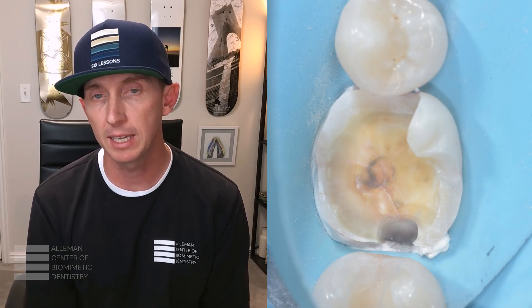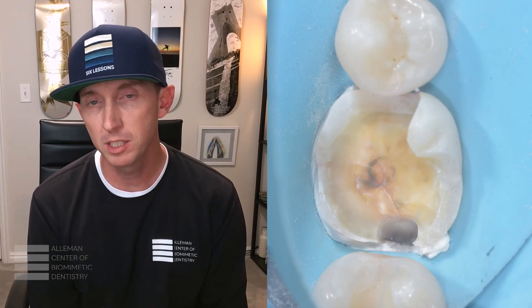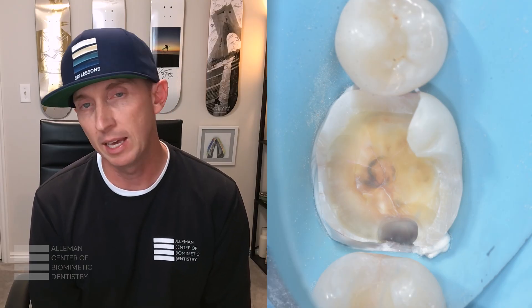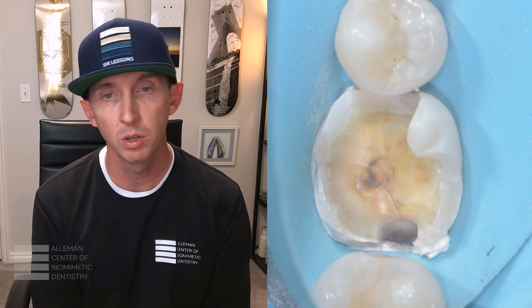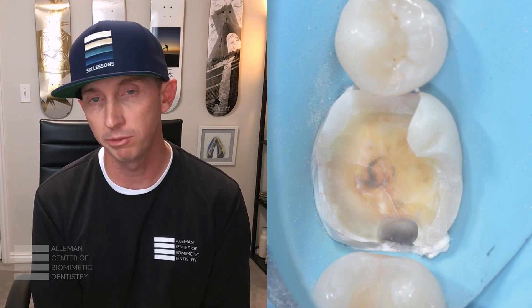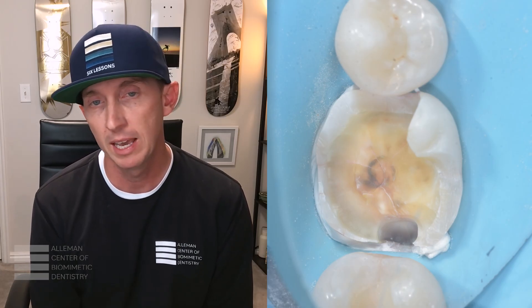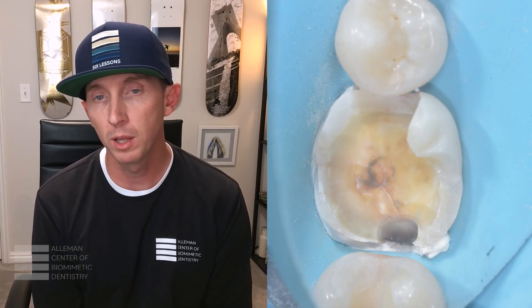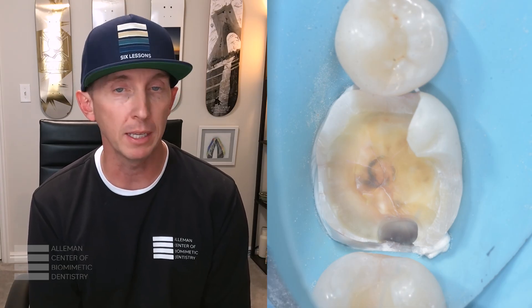This has made many dentists hesitant to embrace the idea of a deep margin elevation. This is not a new concept — it was introduced in the literature back in 1998. As we've continued to follow these cases over the last two and a half decades, we are beginning to feel more confident that the biologic width dogma is a myth, and that if you do your adhesive protocols properly, you will have healing — eliminating the need for crown lengthening surgery in many cases.